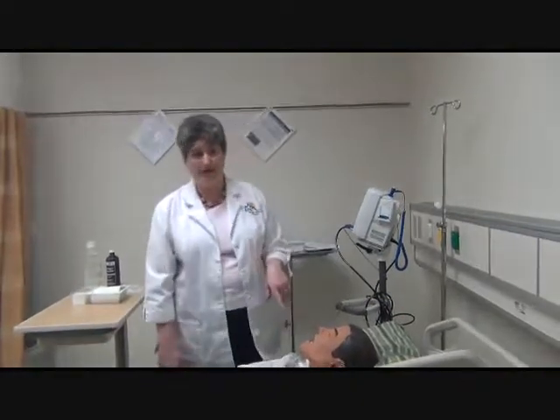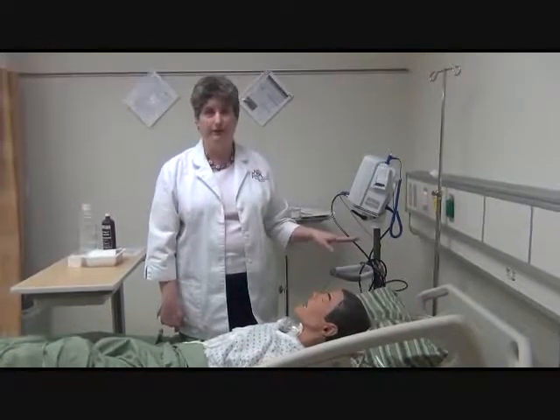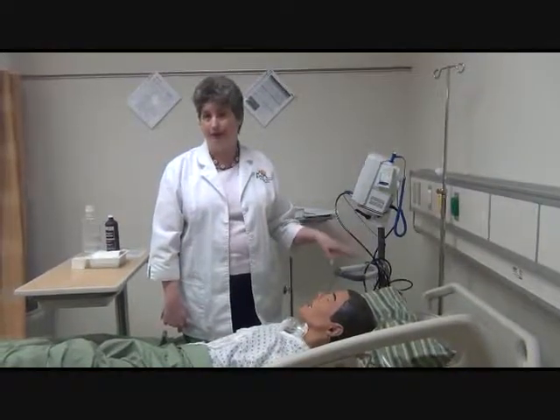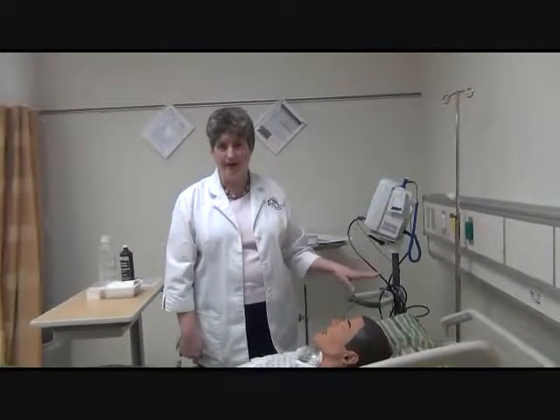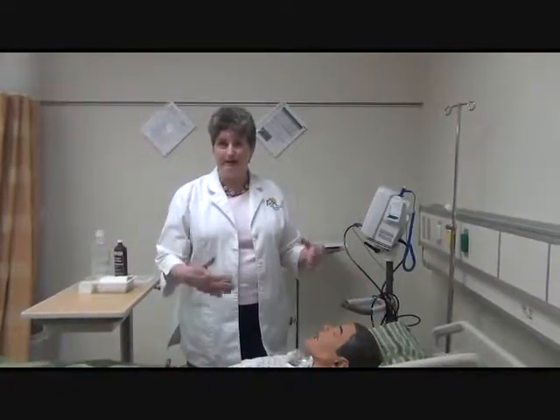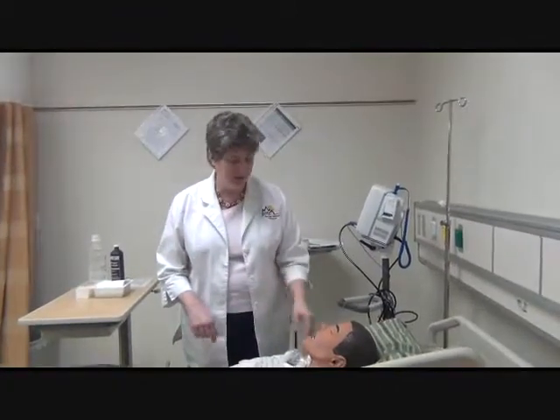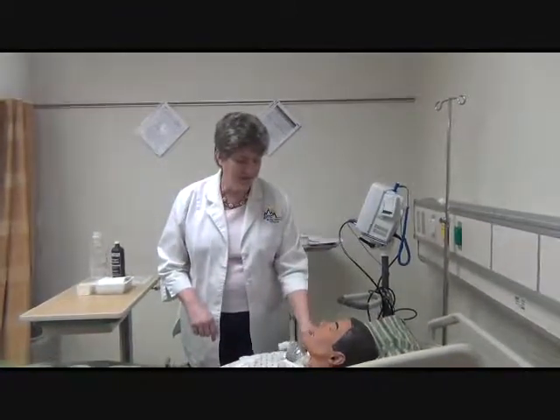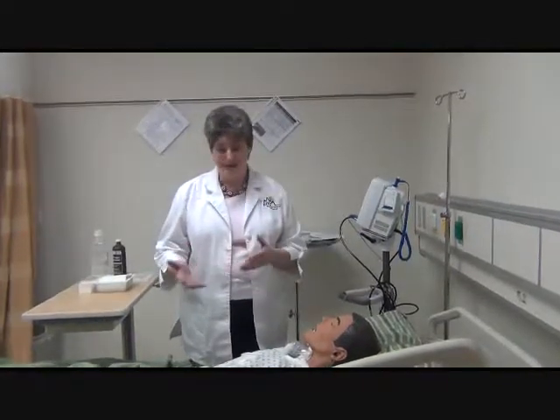If they're on a ventilator, there are some buttons you push that cause them to take a series of deeper breaths prior to the suctioning, or go through what's called a sigh. And again, this just makes them take in a deeper breath and hyperoxygenate in the meantime. So if your patient is getting oxygen, I would recommend a second person to assist you.